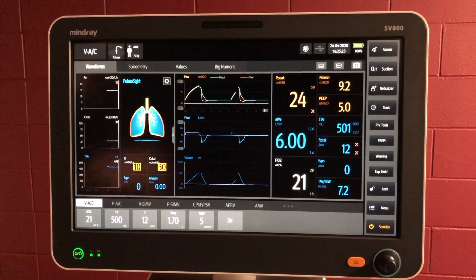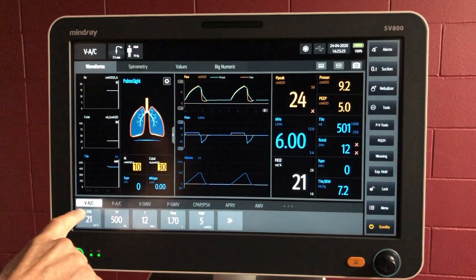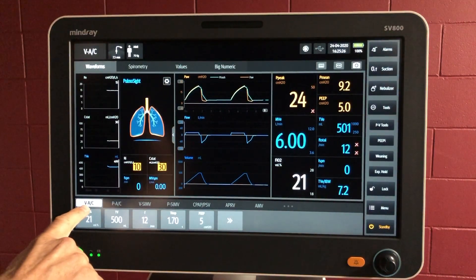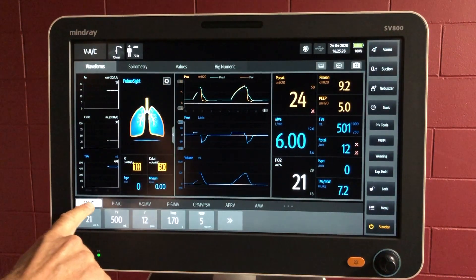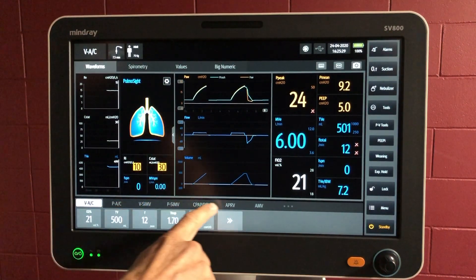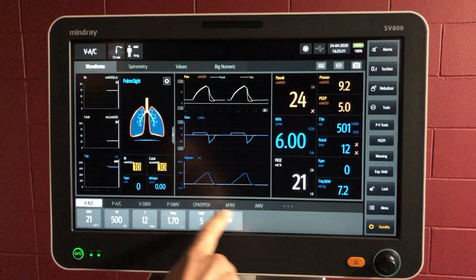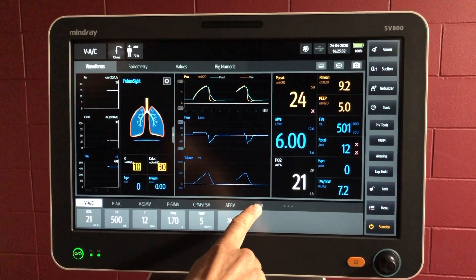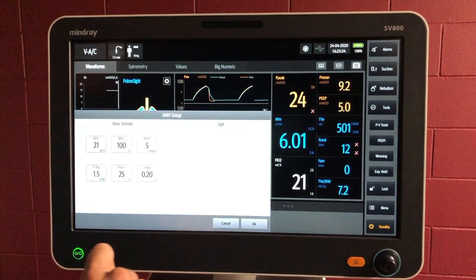To move over from another ventilation mode — at the moment we're in volume assist control — we can go along this line and there are other modes available. AMV is at the end in this case.